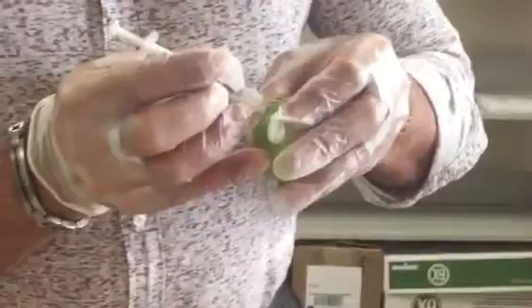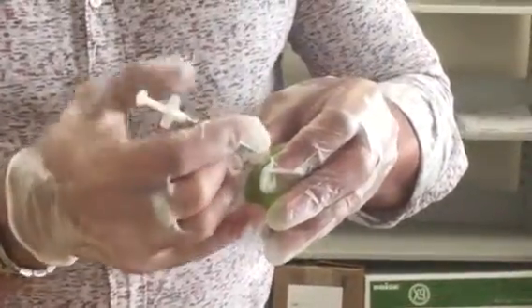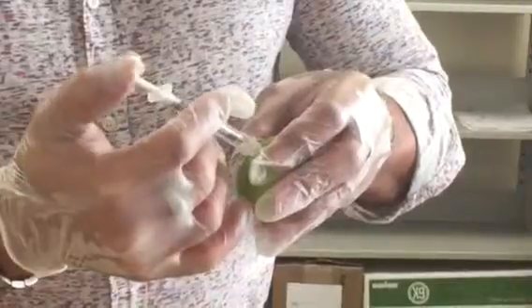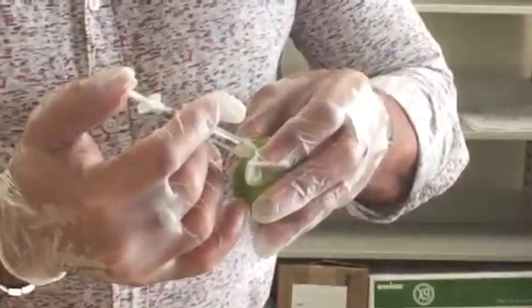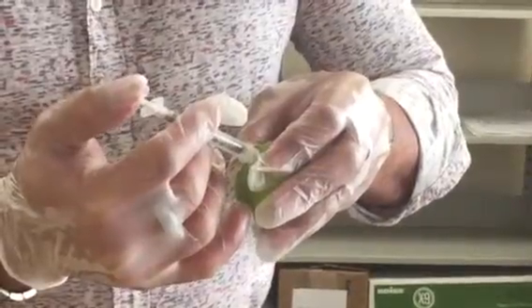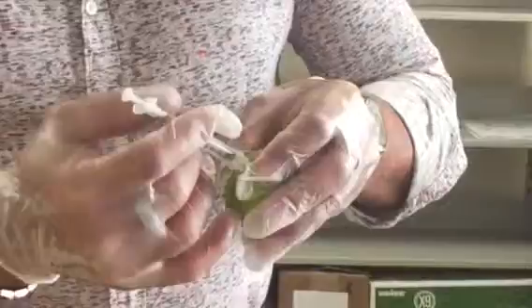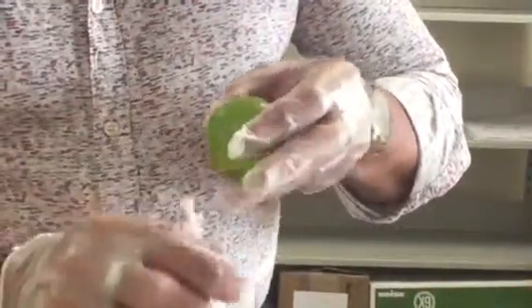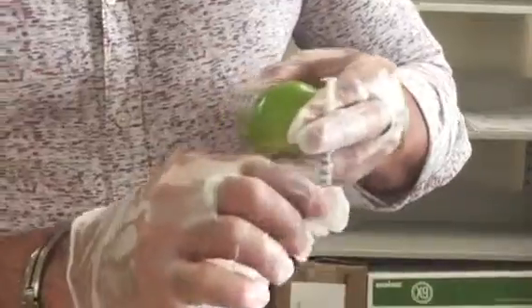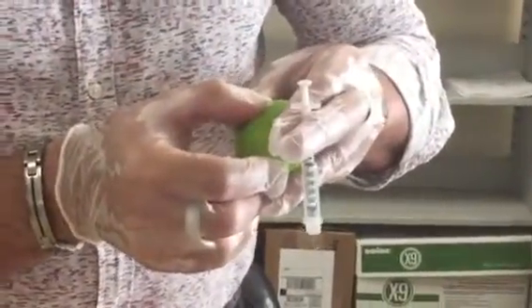Push the needle all the way into the skin. Inject the insulin slowly until it is all in. Leave the syringe in place for 5 seconds after injection. Pull the needle out, put the syringe down, and press the site for a few seconds after the injection.